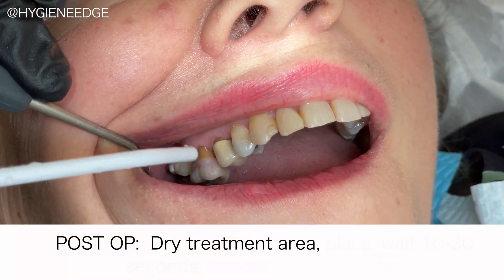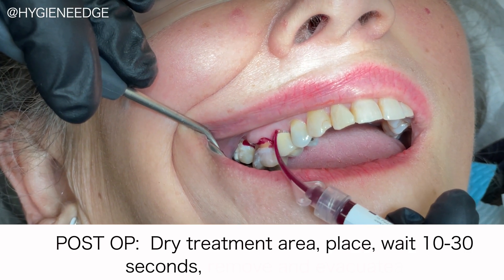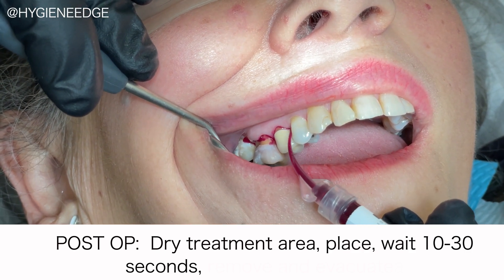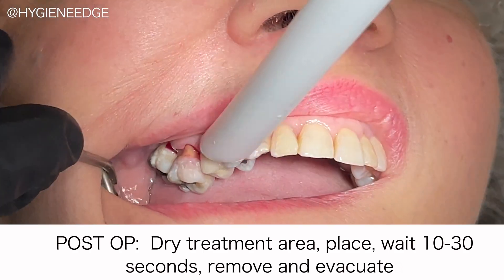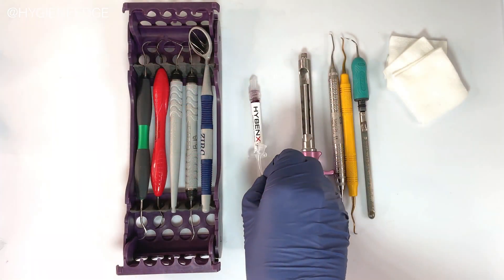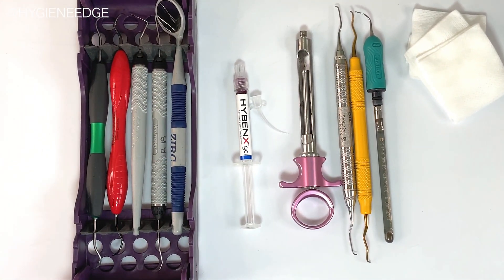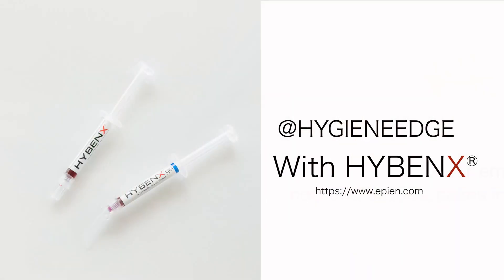After scaling, apply once more by drying the treatment area again, and this time apply Hybenex to the deepest point of the pocket until it reaches the gingival crest. This will dehydrate the entire microbial environment, leaving it bacteria-free, allowing natural healing to begin immediately. And one syringe is all you need for both pre- and post-scaling.